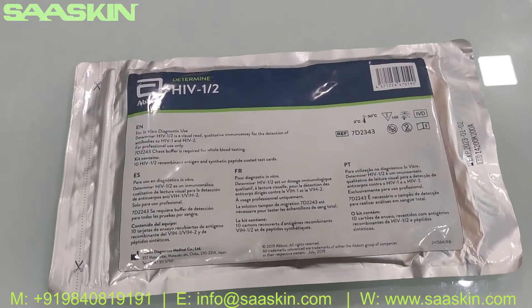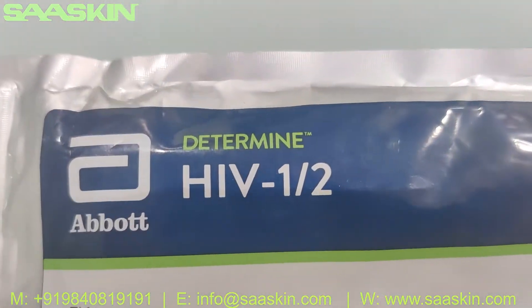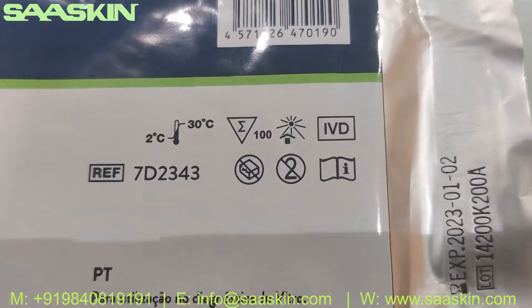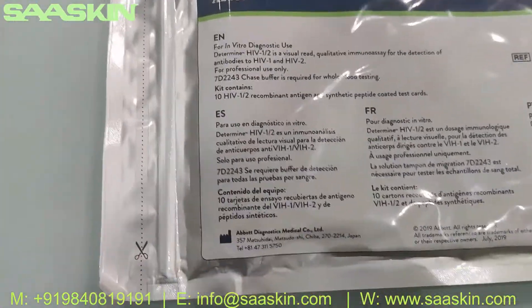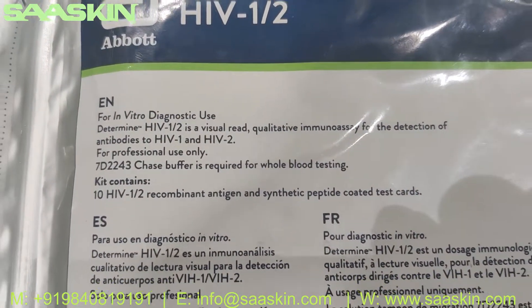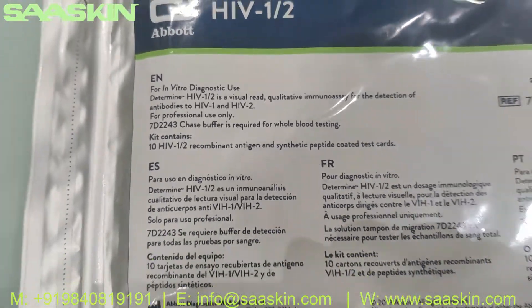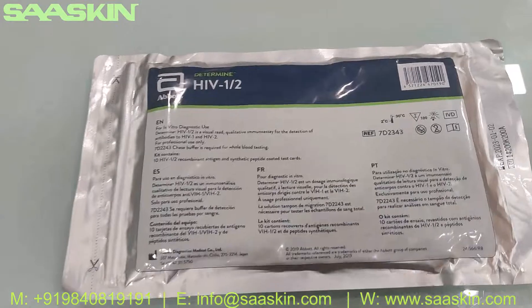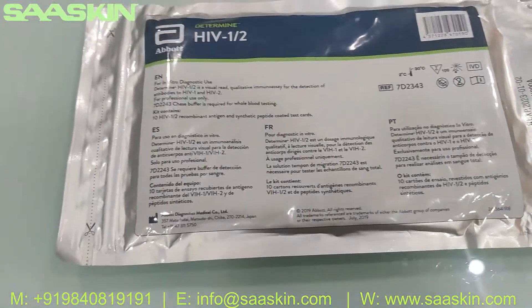Hello everybody, today I'm going to give you an introduction and unpacking of the Abbot Determine HIV 1/2 test pack. This is a complete IVD certified product — an under-test kit for detection of antibodies to HIV 1 and HIV 2. This is for professional users. You may use a chase buffer if you are testing with whole blood, or you can directly use blood serum. If you use serum, you don't need the chase buffer; otherwise you have to get it separately.